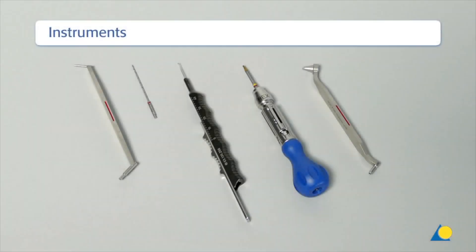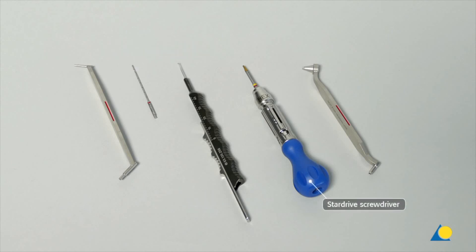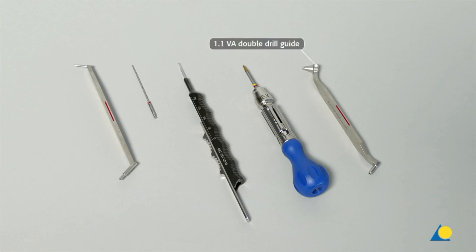The required instruments for reduction and fixation are the 1.5-1.1 double drill sleeve, the 1.1 mm drill bit, the depth gauge, the star drive screwdriver, and the 1.1 variable angle double drill guide.